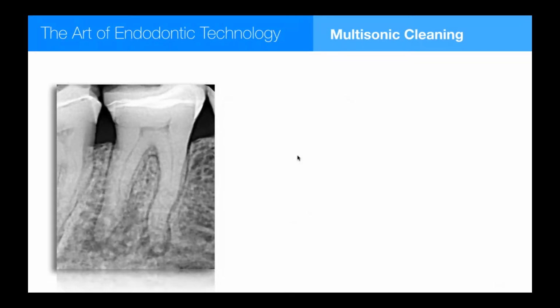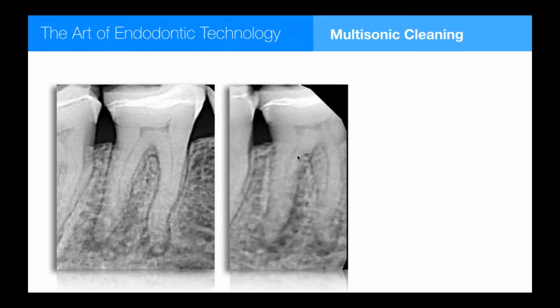And here's the fourth case I've done. I did this on Thursday this last week. It's wavy gravy roots, almost no pulp chamber, super skinny. You go into these cases knowing that it's going to be a torturous pathway to get to length. Distal view shows me the breadth of the mesial root. Obviously, there's 2 canals in there.